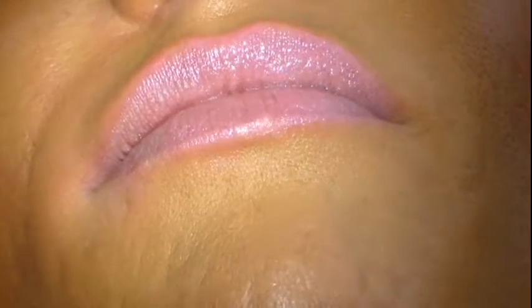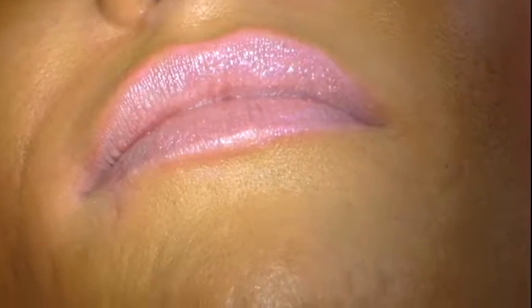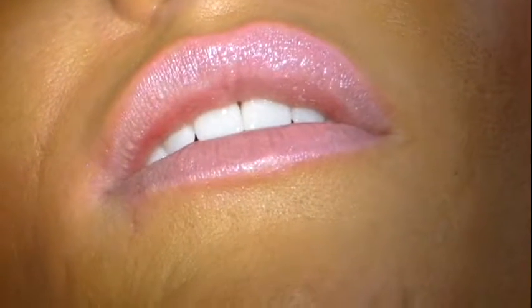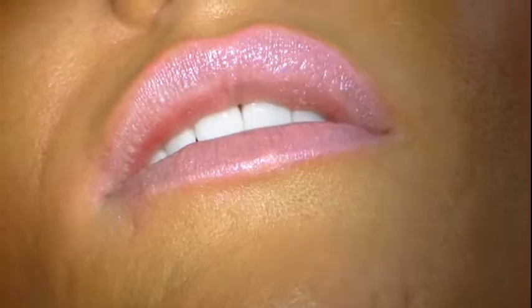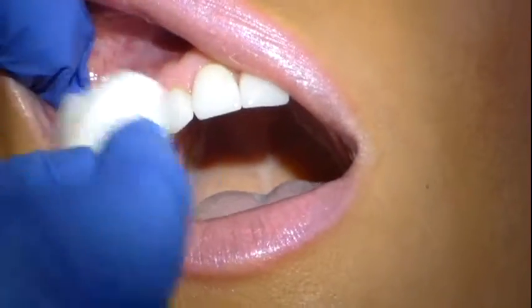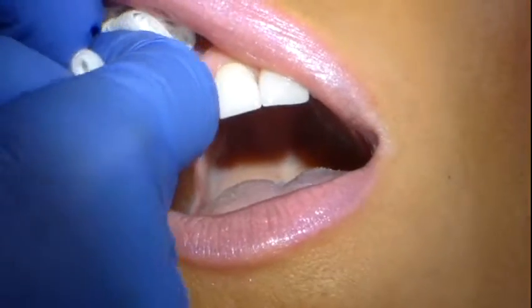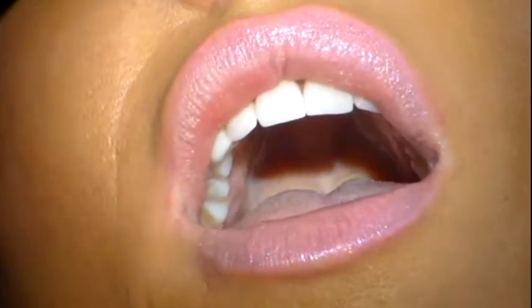We're going to demonstrate the ASA injection, the anterior superior alveolar injection. The first thing you always do is debride the area with gauze to get the bacteria out and make sure it's nice and dry for the topical. Then you're going to put the topical on.